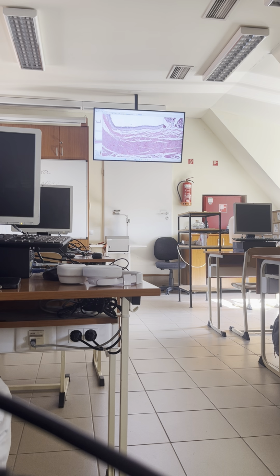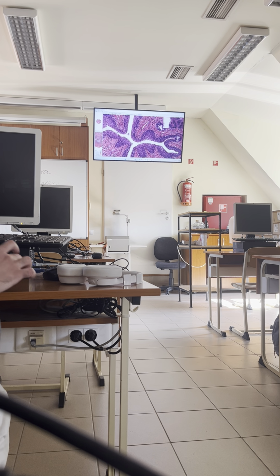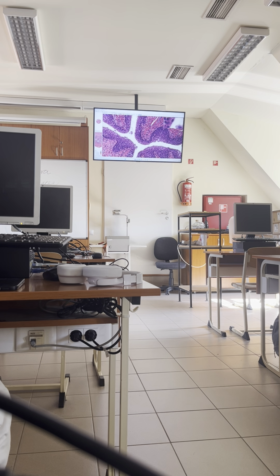Well, I'm still not sure what you mean, but do you mean that in the fetal penis, the urethra shows signs of transition in terms of the lining epithelium? Okay. So if you look at this fetal penis, the lining epithelium of the urethra here, in some places like here, looks like stratified squamous non-keratinizing.